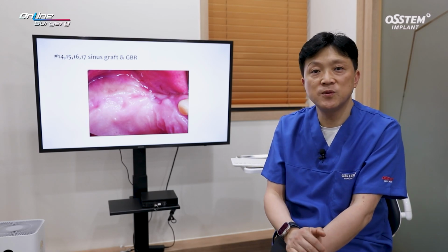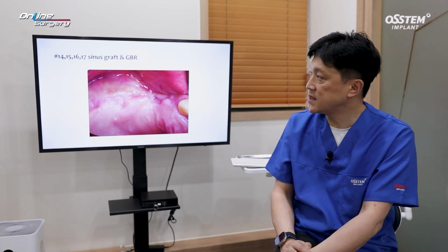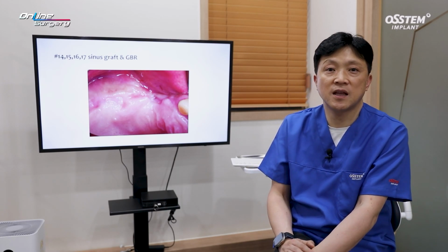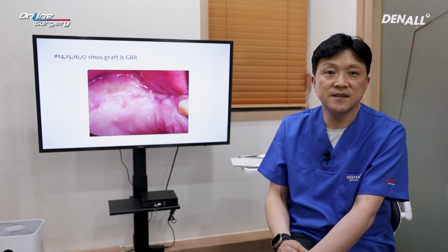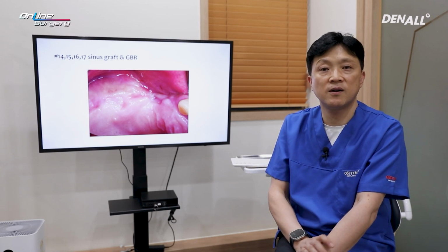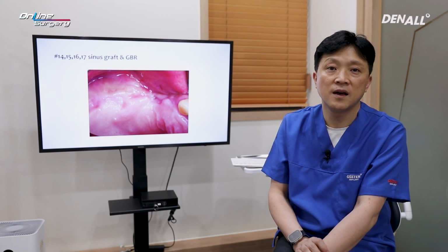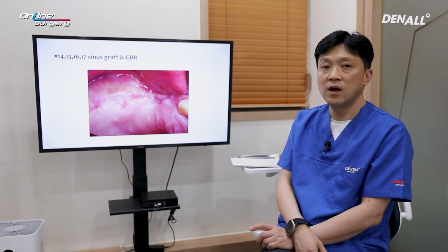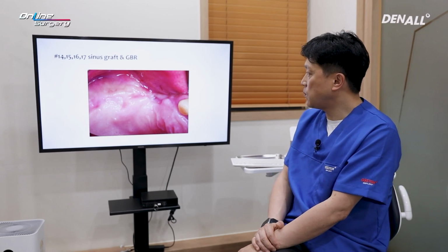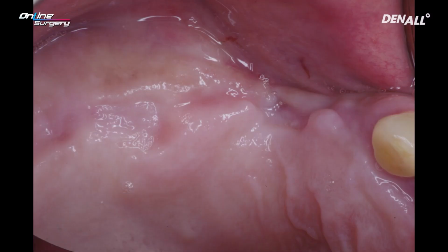Let me introduce the online surgery case of the day. You can see that numbers 14, 15, 16, 17 are missing. The patient required sinus graft as well as GBR. Placing implants simultaneously could be good, but the situation did not allow it. Implants were not placed and only bone grafting was done.